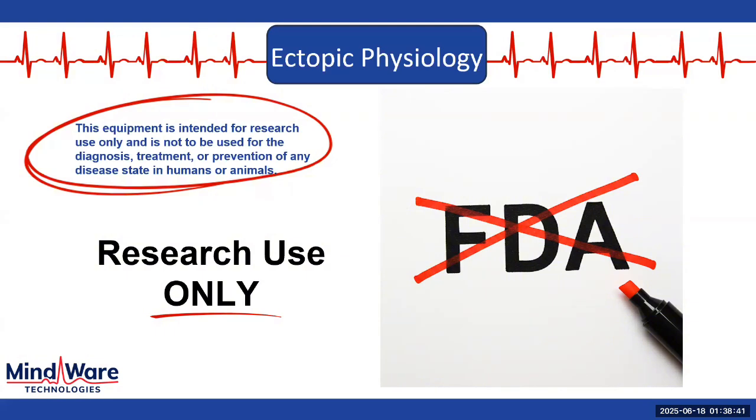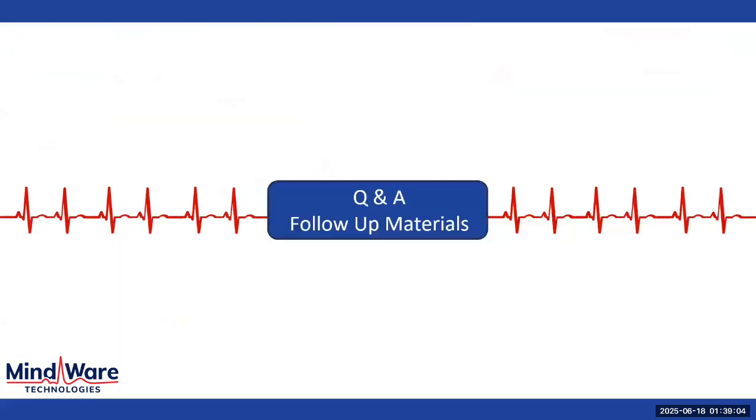Something that might be common is, how do I look? How healthy am I? So, stay away from that knee-jerk reaction of, oh yeah, everything looks great, or, you have an issue here. Stating that this is for research purposes only, and that clinical interpretations cannot be made from it, is a very helpful stance and statement.